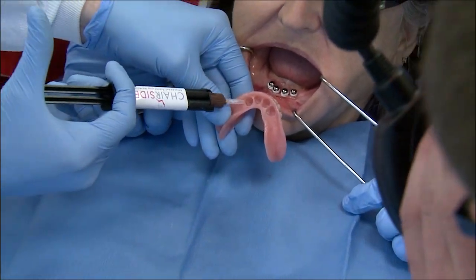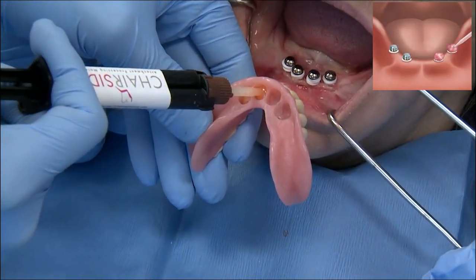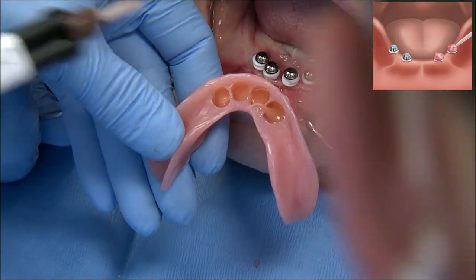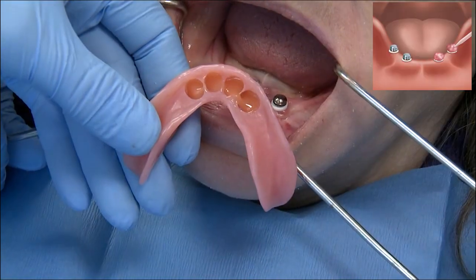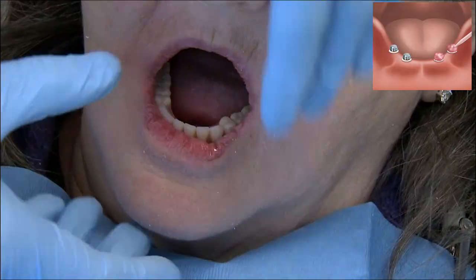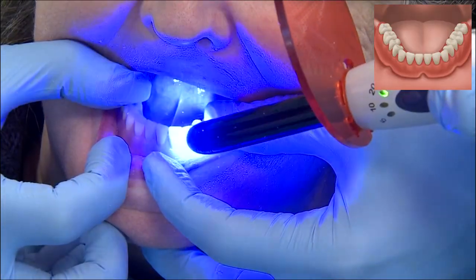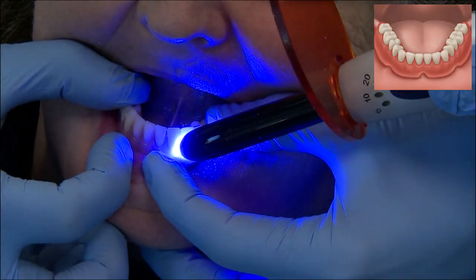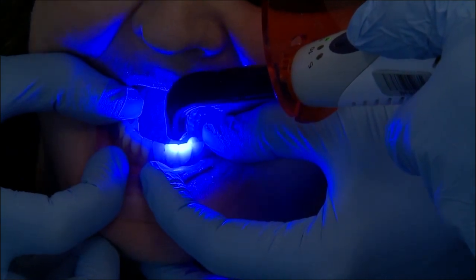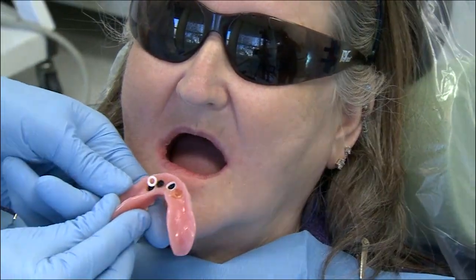I'm injecting the Zest Chairside attachment processing material into each one of the recess holes. I don't like to use the angle tip here, only the mixing tip, for ease of use. I inject until it's about two-thirds of the way full, also verifying that none of the material is dripping out through the intaglio surface onto the edentulous ridge. Very carefully, I seat the denture onto the edentulous ridge with my fingers in a passive orientation, holding the denture gently and evenly, having the patient rest their bite. I don't recommend having the patient bite down during this procedure — simple finger pressure ensures the denture sits intimately to the soft tissues. The chairside attachment processing material is a true light cure dual cure option, and we're accelerating the set with a light cure. After about two minutes, we carefully remove the complete denture, inspecting that we've successfully picked up all four denture caps.